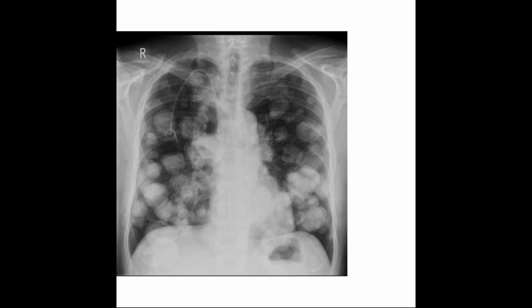Breast, I'm not aware of. It may be possible. Pancreas is unlikely. Adrenal usually has lung mets, but not classical cannonball. Bone, no. Bone cancer, no. Yeah, so we keep renal, choriocarcinoma, ovarian carcinoma, colon carcinoma as the ones which I am aware of. Breast, you guys can check. Adrenal, I think, does not present as cannonball metastasis, or if it does, it may be a very rare presentation.